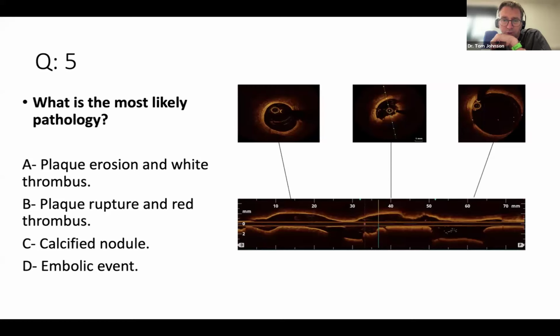And if you look at the longitudinal contour where the yellow-blue line is set at the moment, if that's where we're looking at that middle panel, then from the irregularity of the lumen profile it looks like that thrombus might extend from about 32 millimeters up to about 50, 52 millimeters. So you've got a fairly extensive segment of thrombus.